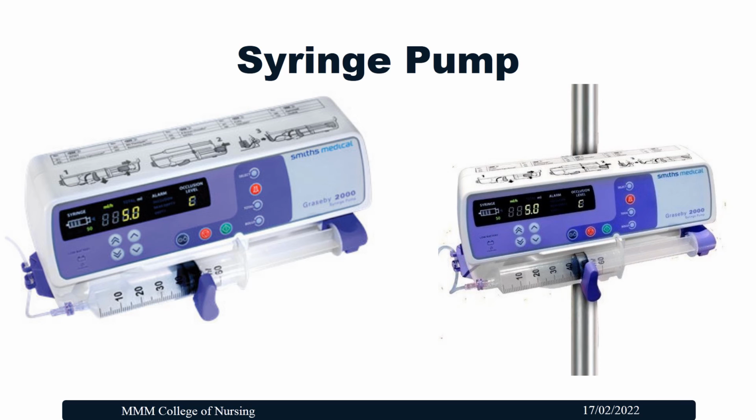These syringe pumps can be fixed along with the IV stand, and they are also equipped with a battery. So when there is no electricity supply, it can work for a certain period of time through the battery, but the batteries have to be recharged regularly.